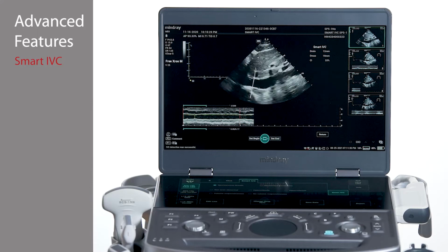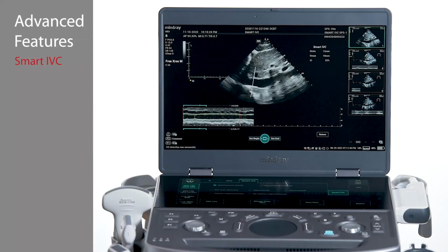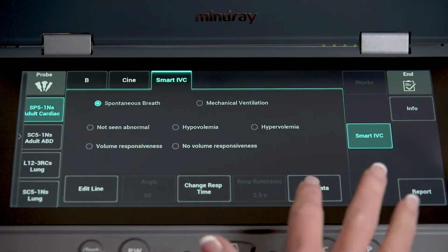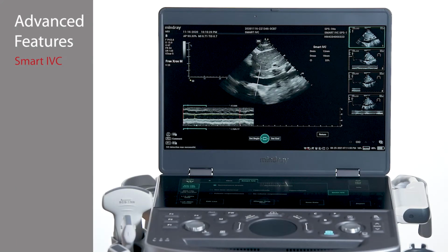If sampling position is suboptimal, tap the Edit Line tab. This will allow for modification of the position and angle of the sampling line. To initiate a graph displaying the results over time, which will appear in the upper left corner of the imaging screen, press the Save Data tab in the lower right corner of the touch panel.